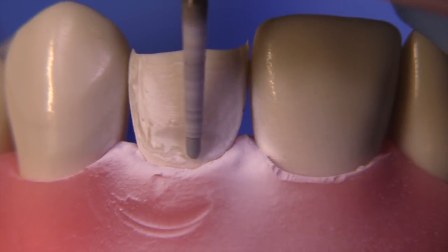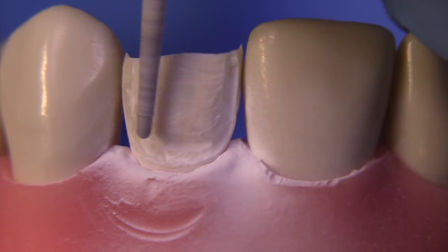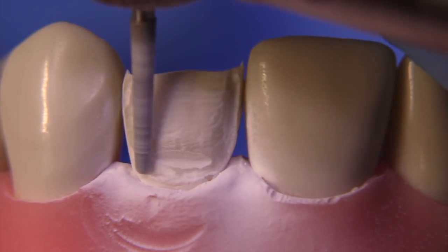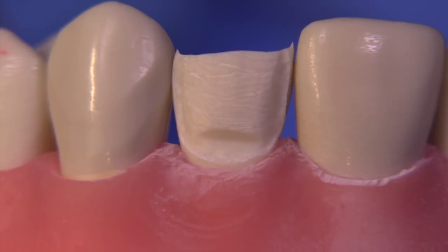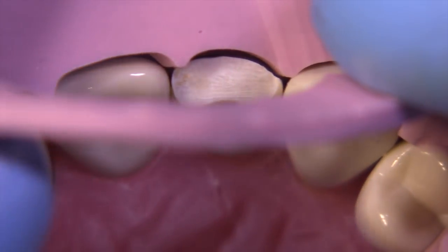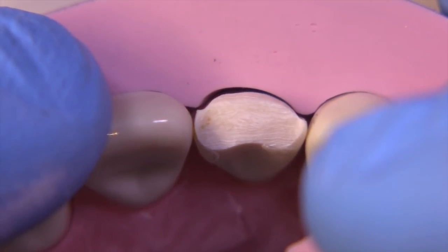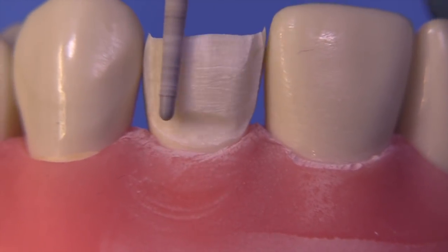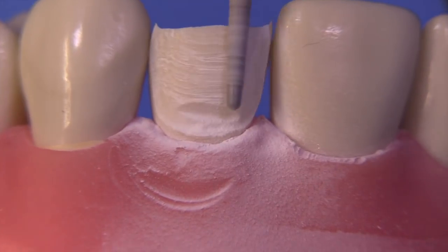You can see how I'm using the burr to go up the vertical walls, and I'm trying to get the finish line to follow the gingival architecture while reducing the facial. Some may ask why I didn't use depth cuts in this case — I usually would, but I wanted to show how we can utilize the stent without depth cuts to make adjustments to our reductions. Looking at it now, the reduction is completely off: the distal is significantly under-reduced, and so is the mesial. We're going to have to spend more time reducing the facial, but the prep guide is an awesome way to do this even if you chose not to do depth cuts.